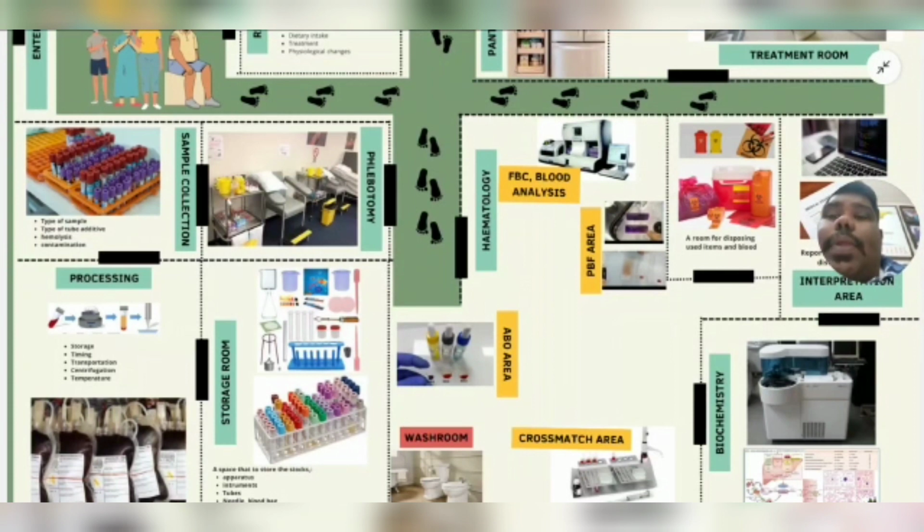And besides that, there will be a PBF area where we will be doing our blood smear, and for that we need a proper water supply and a proper place to discard water. They must prepare a better flow for us to conduct the experiment and the staining as well.